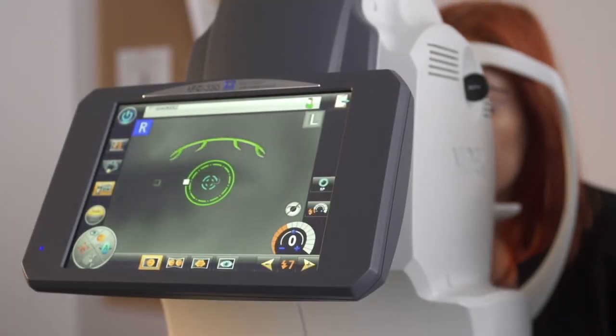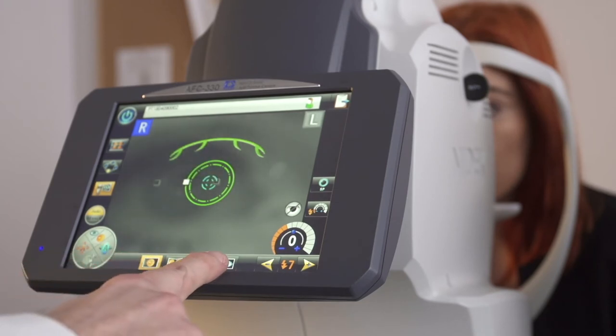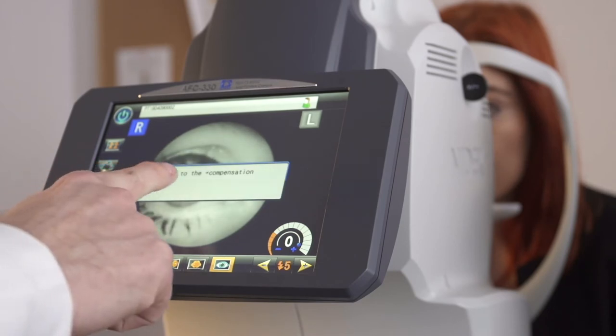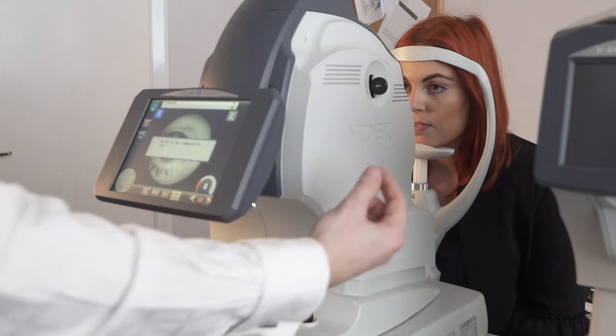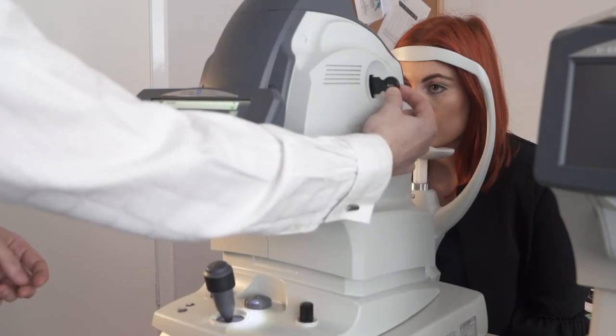So now we're going to take an anterior eye photo. For this one we press the last icon. On screen it will ask you to add the plus compensation lens, which is this paddle at the side — just pull it out as far as it will go.